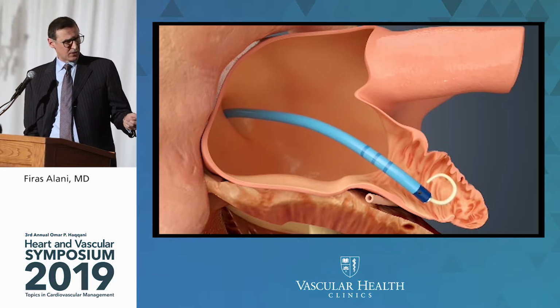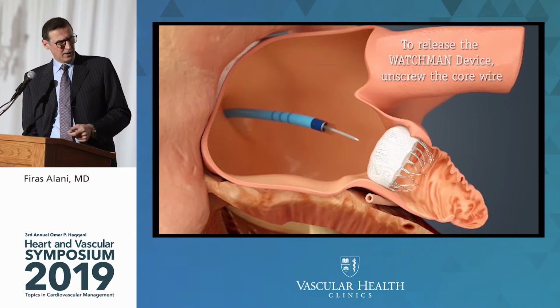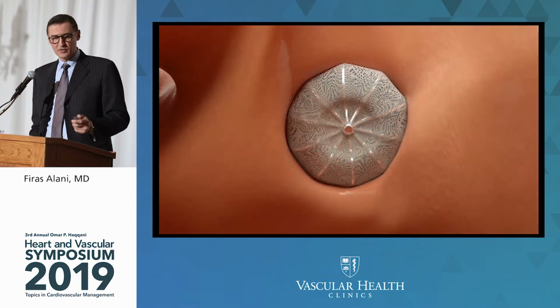So the device gets put in, and then you can forward through the rest, please. And then you can go towards the end, and then the device gets deployed. And then before we release it, we make sure it's anchored, and then usually after 3 months, the device endothelializes. Next slide.